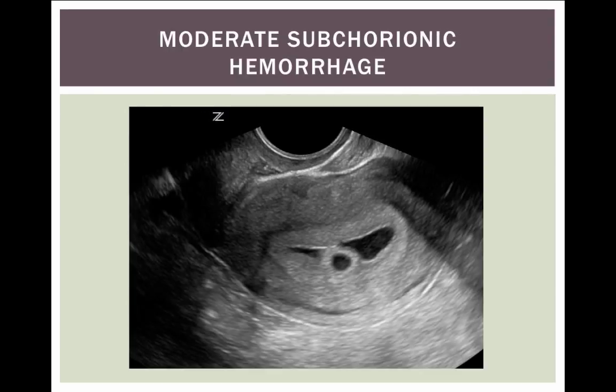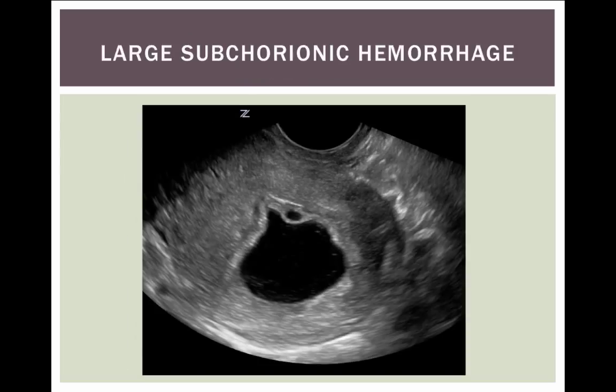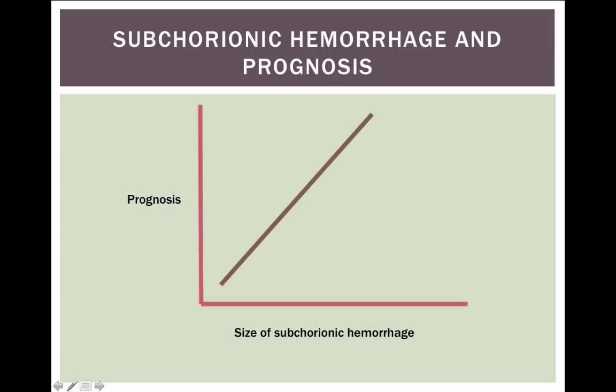This next one is a little bit bigger. Does this mean the patient's going to miscarry? There's not a 100% prediction rate, but the prognosis does get worse the bigger the hemorrhage is. This is a pretty large one - the prognosis is probably poor, although I still wouldn't definitively tell the patient they're going to miscarry. I would tell them there are some features that need to be followed up. Bigger subchorionic hemorrhage tends to be worse prognosis, but don't be too definitive or committal about it.